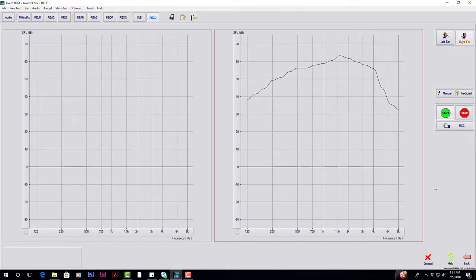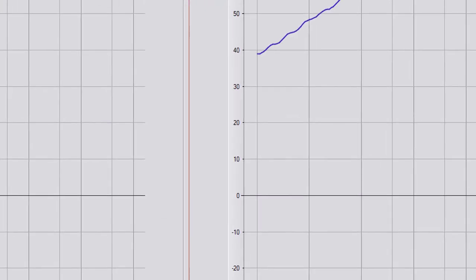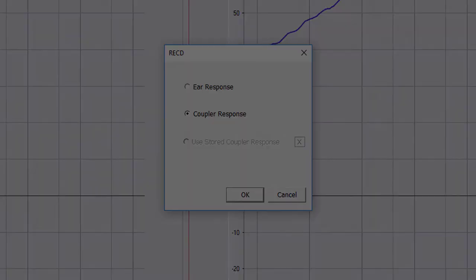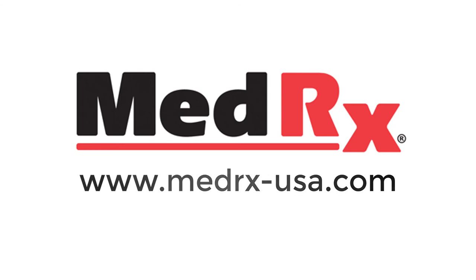Once the ear measurement is complete, you will be prompted to perform a coupler response measurement. Select the ear adjustment to use the wand-through method and select the appropriate instrument receiver.